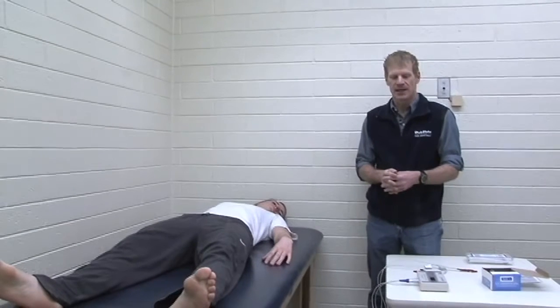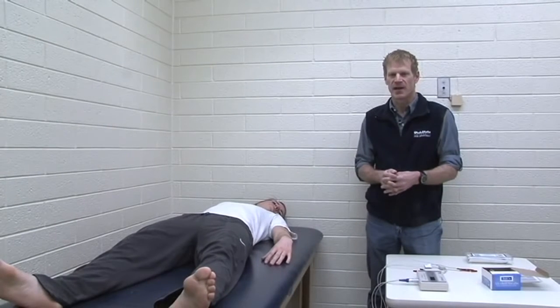BIA sends a low-level electrical current through the person's body — it's so low that the person can't feel it; it's a low-voltage, low-frequency current. A large portion of the body is water, so generally we're good conductors, and the water content in the body is found in the fat-free mass. The fat mass is essentially anhydrous or free of water, so really the only thing impeding the current is the fat mass. That's really what we're measuring when we do bioelectrical impedance.